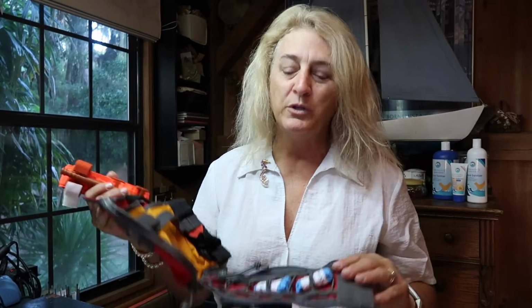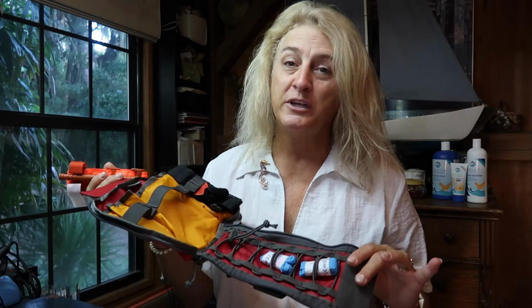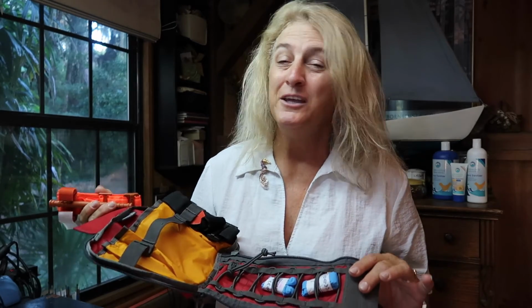Like I said, it's very simple. It is not a boo-boo kit. It is a bleeding control kit. It's to keep someone from bleeding out. You've got 3 or 4 minutes before they can lose all their blood and they're going to be gone. So time is of the essence.